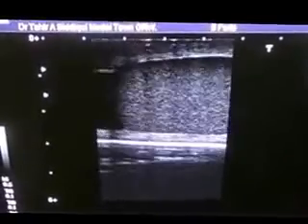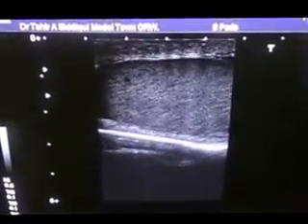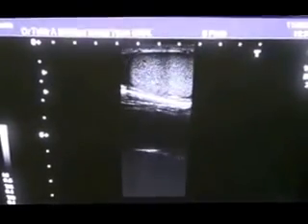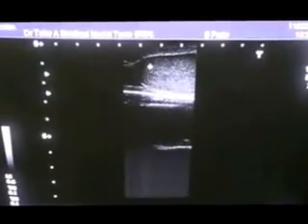Now I am shifting towards the right testis. This is the right testis, you can see. This is the lateral border, and this is the medial border.